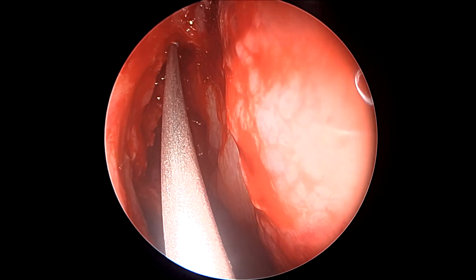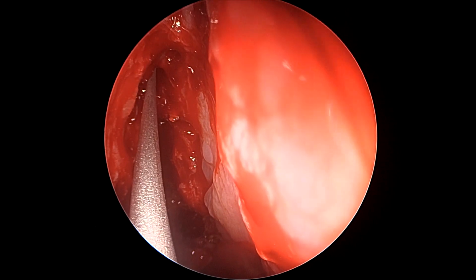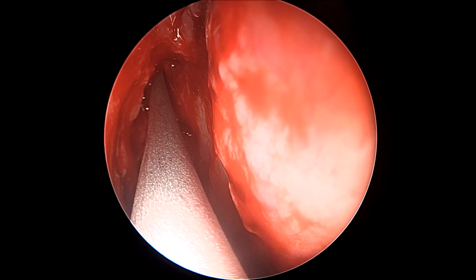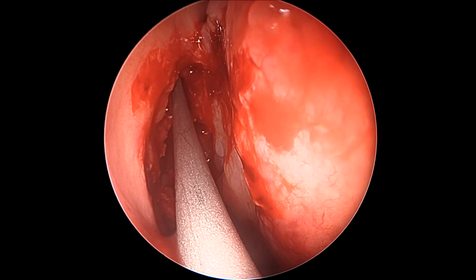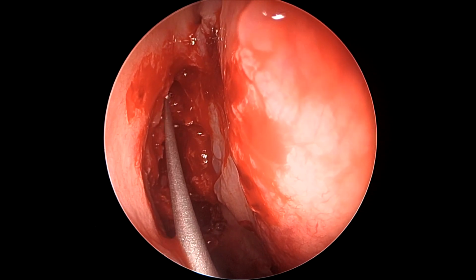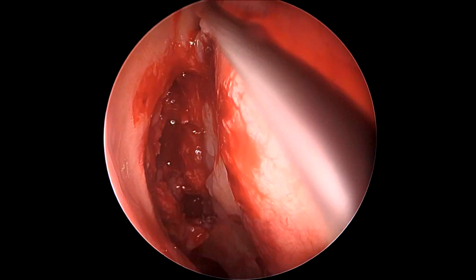Now we are using an angled navigator probe to point at the frontal beak area where it starts, and taking our navigator probe posteriorly to locate and guide us inside the frontal sinus. This can normally be encountered behind the agger nasi when you fracture the posterior wall of the agger nasi, like such. As you see here, our probe is going inside the frontal sinus. It obviously goes superiorly and laterally inside the frontal sinus. As you see here, behind the agger nasi cell, freely.